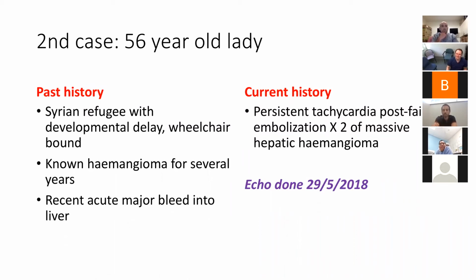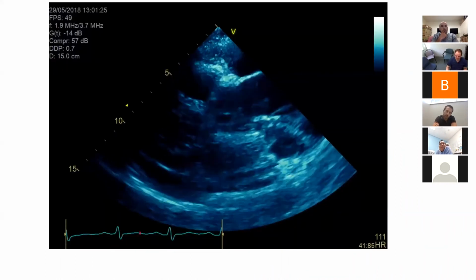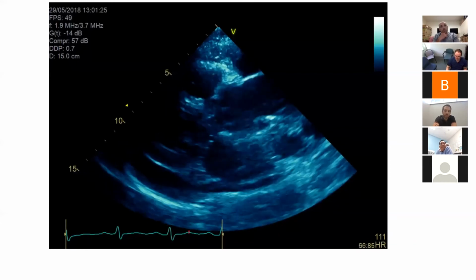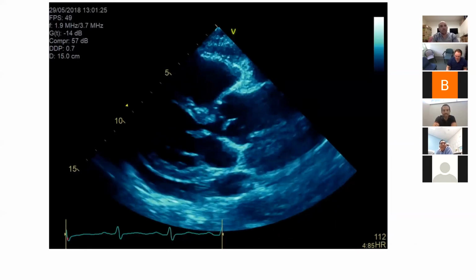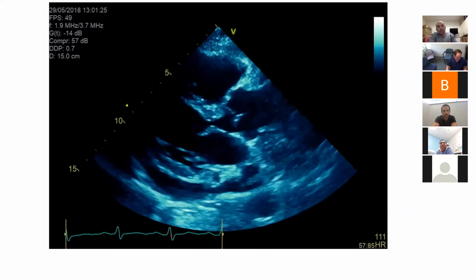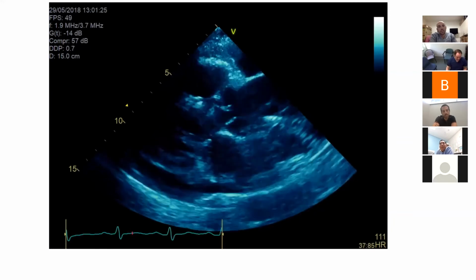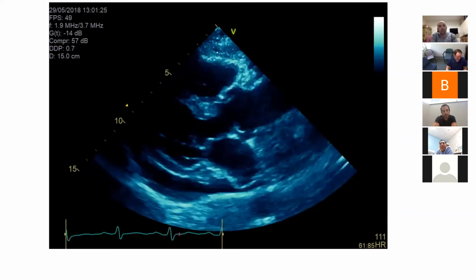Right, Lewis, fall into it, man. So the frame rate's not, oh no, it's sped up.